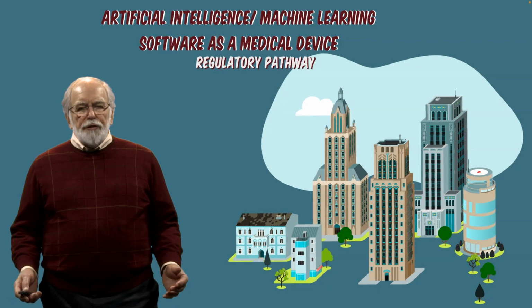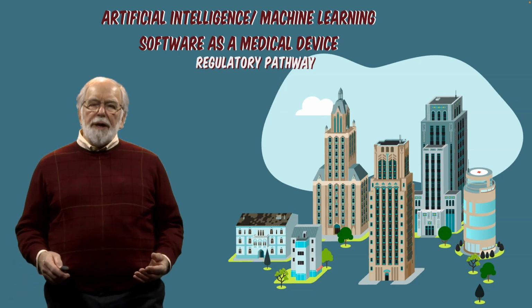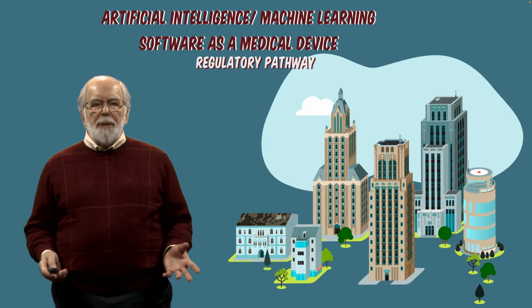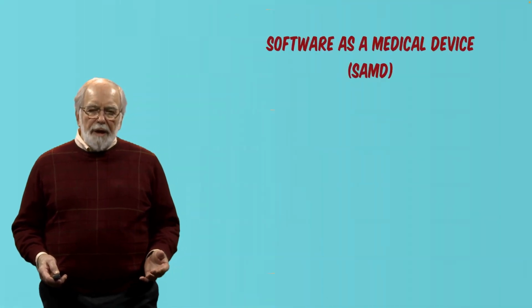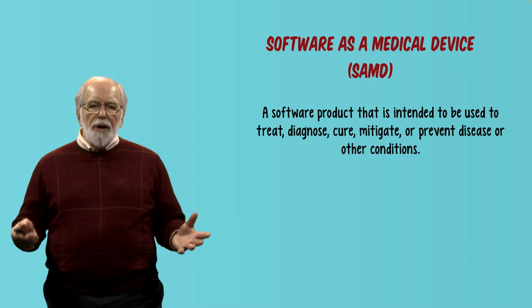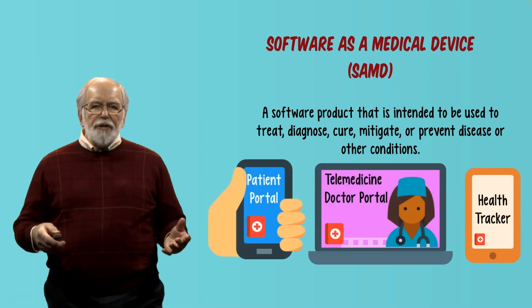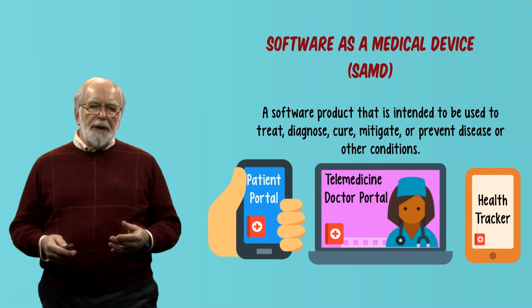Artificial intelligence and machine learning is a technology that's now being incorporated into medical devices. And we call this software as a medical device, or SaMD. SaMD products are products that are intended for use to treat, diagnose, cure, mitigate, prevent diseases. Those are the examples of SaMD types of products.